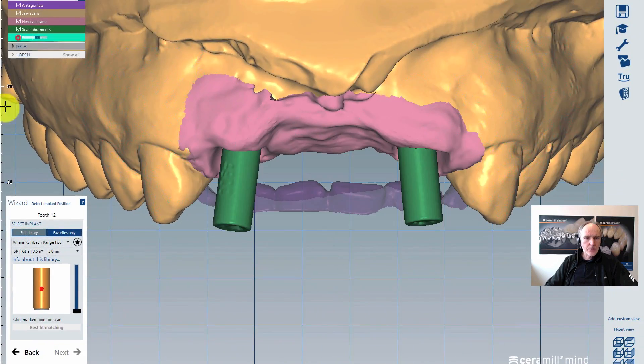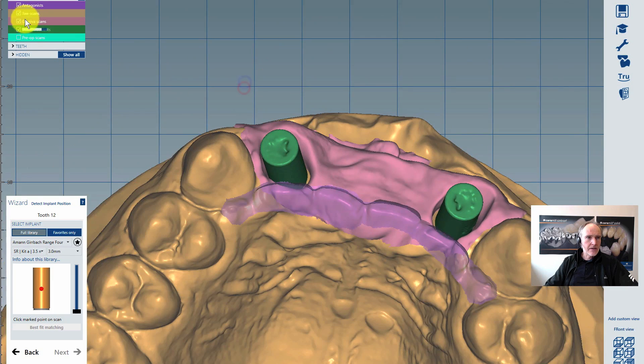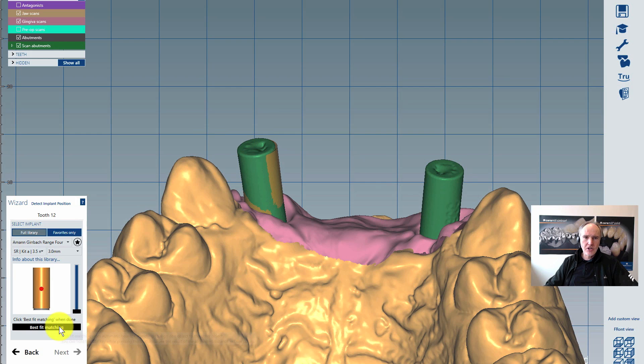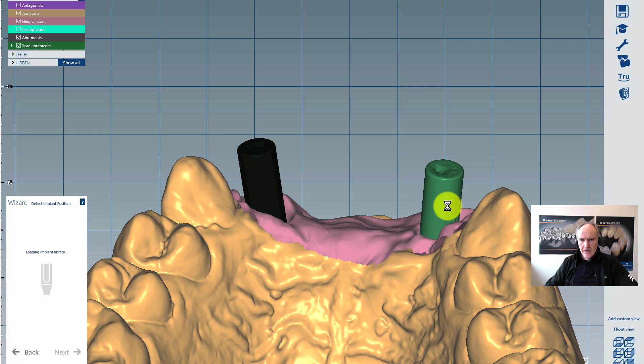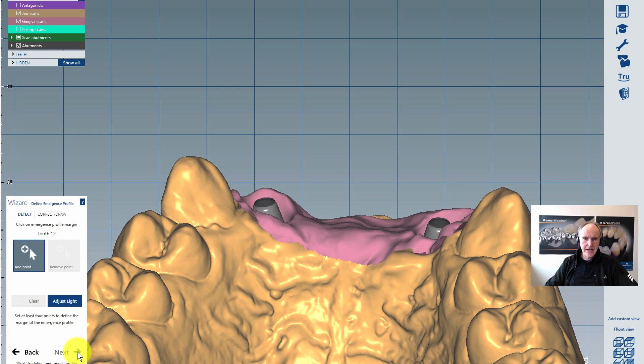Let's put away our pre-op and click on the first abutment without the antagonist. I select it and click 'best fit matching', then continue. That's it — it's a very quick thing. Then go to the next one, also click on best fit matching, and continue by clicking next.